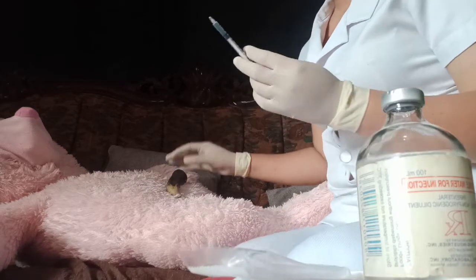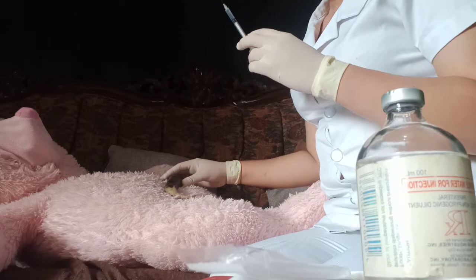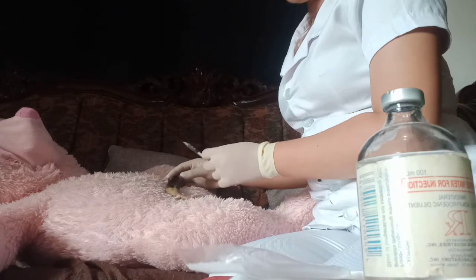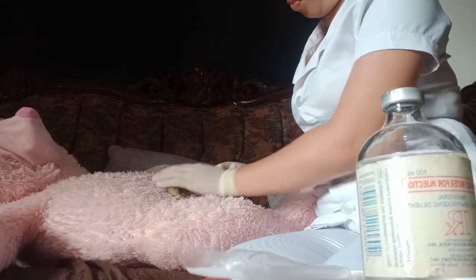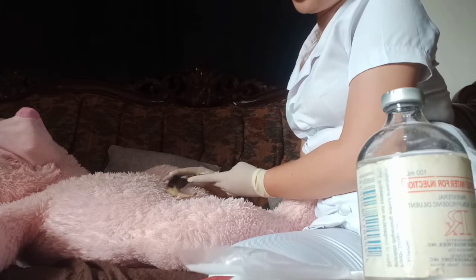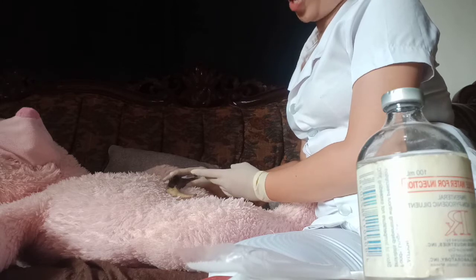Then grab the syringe in your dominant hand, holding it between your thumb and fingers, with the palm facing forward at a 45 degree angle. Then inject the medication by holding the syringe steady and depressing the plunger with slow, even pressure.